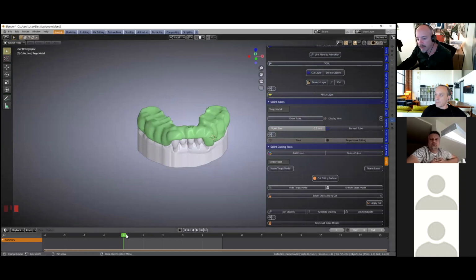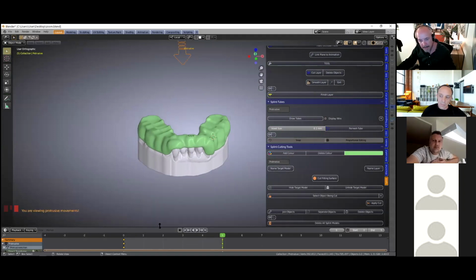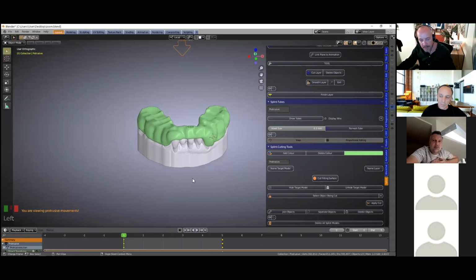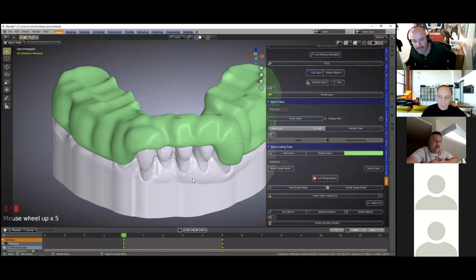Any questions so far? No, it's pretty good, Michael. Actually, at the beginning you started with a matter of full millimeter, keeping in mind how it would penetrate into your working model, if I understood correctly. Wolfgang, I didn't quite hear that. Could you repeat? Now? Yeah, that's better.